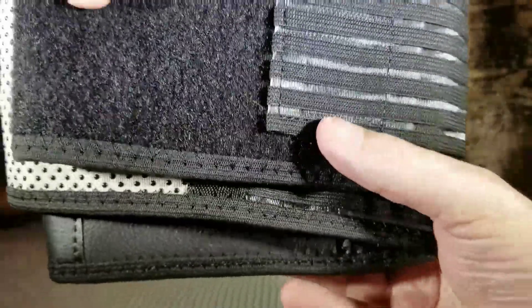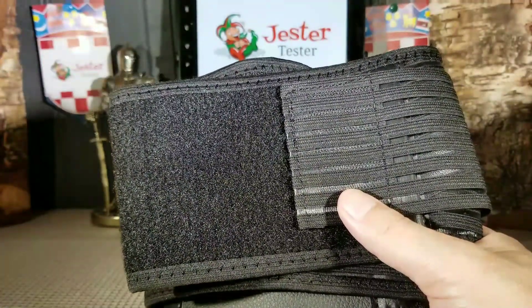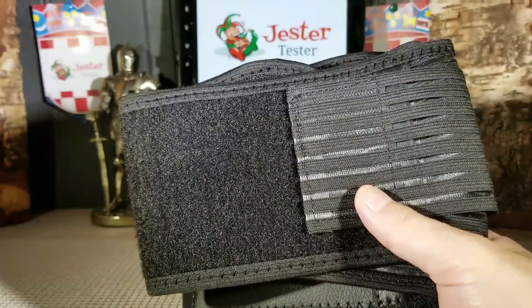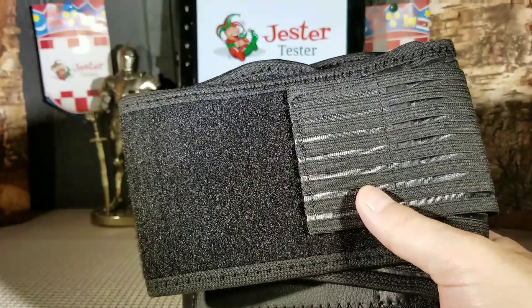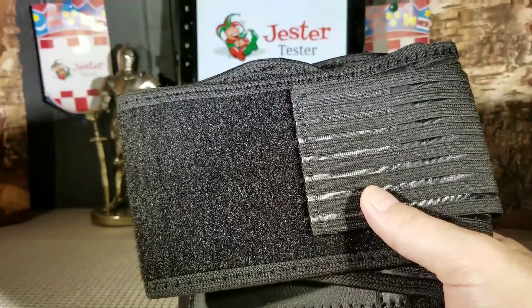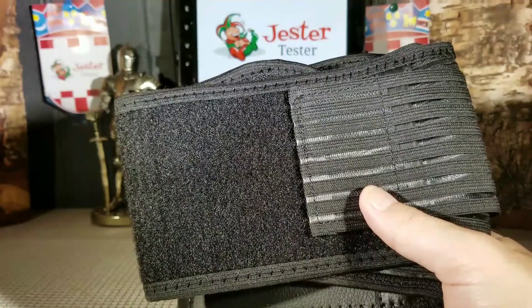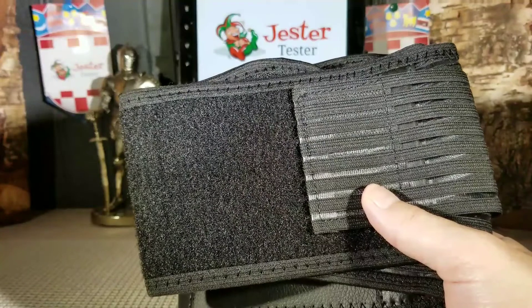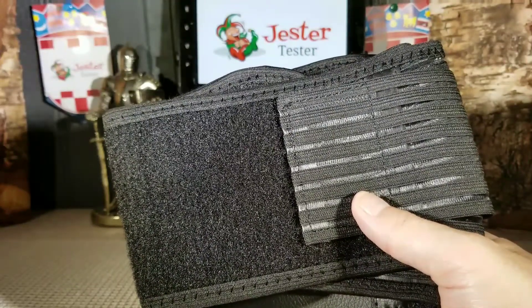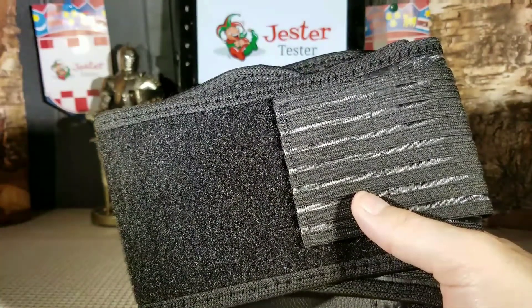Overall guys, it's a nice product. I love the width on it, and I like that it's a little thinner than your normal belt. This fits around a 22 to 38 inch waist. I'm about a 32 to 34 inch, and it's just about snug at that. I'm heading up to the 34 inch side. Even though they say it fits around a 38 inch waist, if you're going from 36 to 38, it's going to be a little bit snug — you're going to be at the very end of the belt at that level. So I would say it's more like a 22 to 36 inch waist comfortably, and at 38 you're kind of at the end mark there.